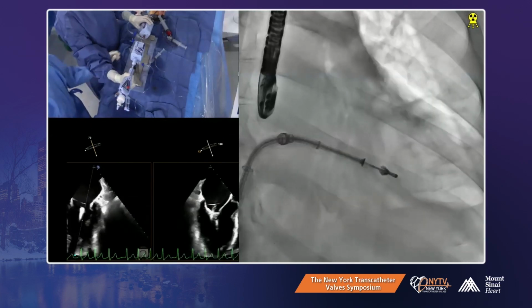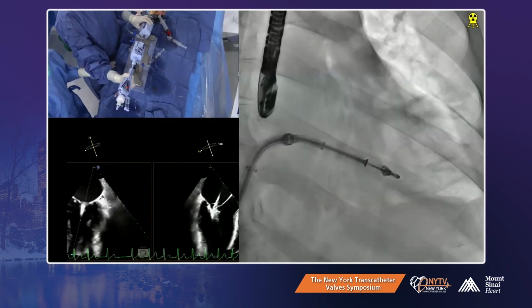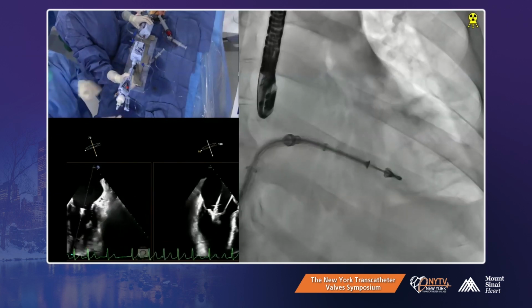We get anterior and then go. Anterior is on. Entry is on.